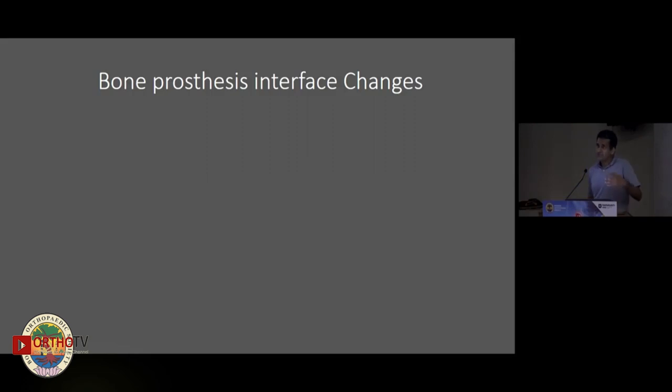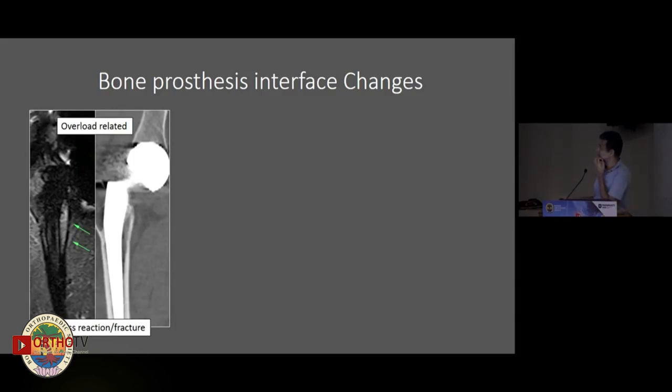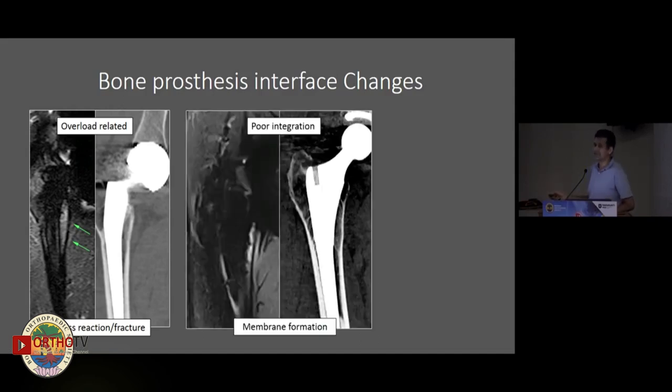When we consider the bone-prosthesis interface, here's an example of somebody whose CT and X-ray look relatively normal but who complains of consistent pain. On MR, you can see significant bone marrow edema along the calcar and medial aspect of the femoral shaft — this is an evolving stress reaction. A bone scan would light up that area, but MR gives us additional structures beyond just the bone.